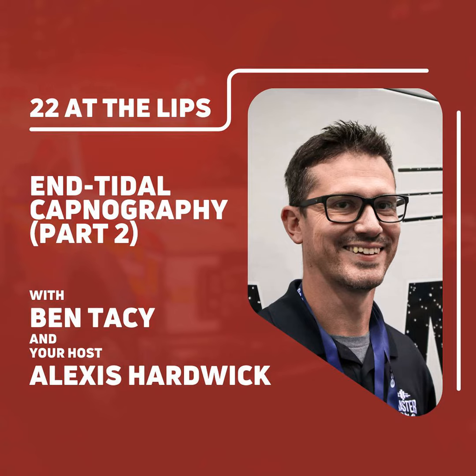Say we're giving them a nebulizer treatment, measuring End-Tidal through their nose, and we see that their End-Tidal's low, like it was 30 before, and now we gave them oxygen, it's 28. Like, oh my God, they're getting worse. Like, no, you're just flowing oxygen. And since it is an instantaneous reading, turn oxygen off for 5 seconds, let them take a good breath in their nose, blow it out their mouth, get a good reading, turn oxygen back on if you want to trend.